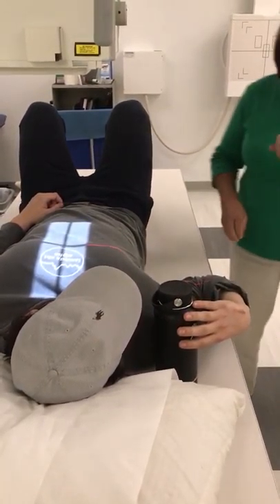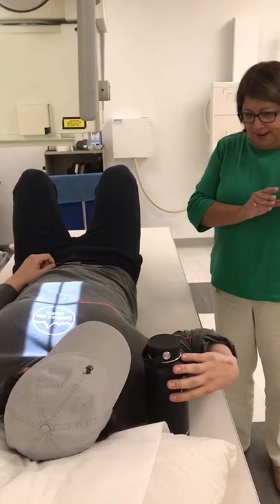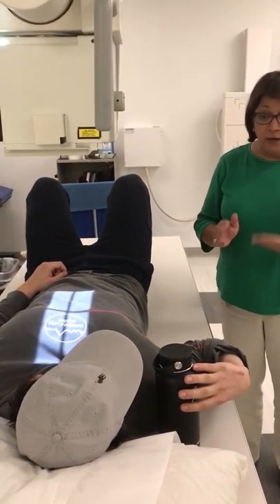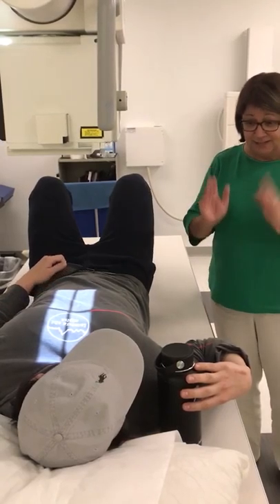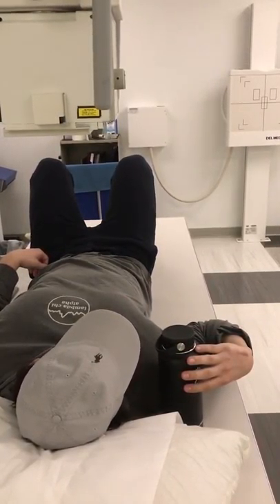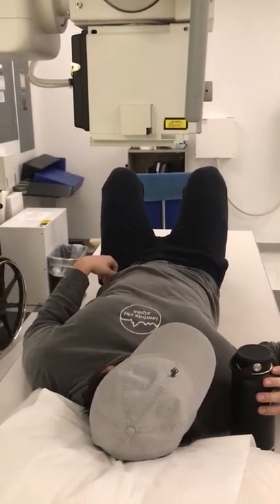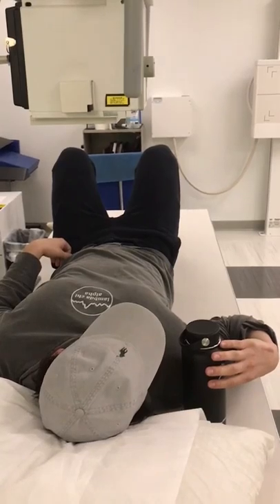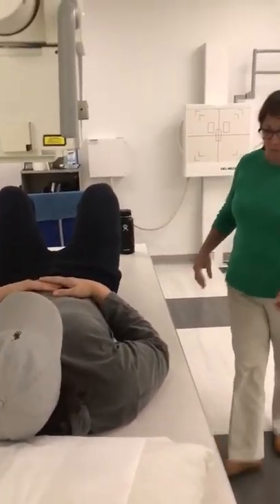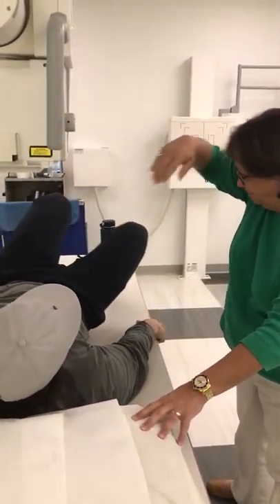Now, I'm going to give you some instructions. When I go back here, I'm going to tell you to start drinking. And I want you to keep drinking the barium until I tell you to stop. Start drinking. Keep drinking. Exposure. You can stop drinking. Next is the RAO. So, sir, I want you to roll over onto your belly. Be careful and don't hit your head.